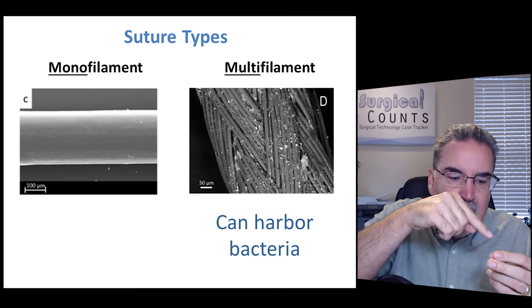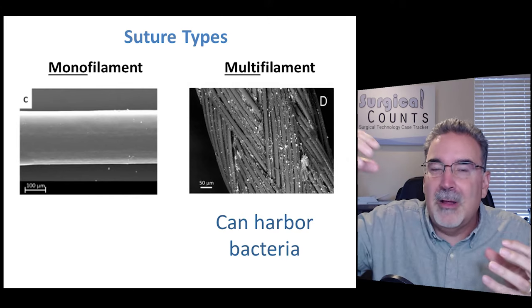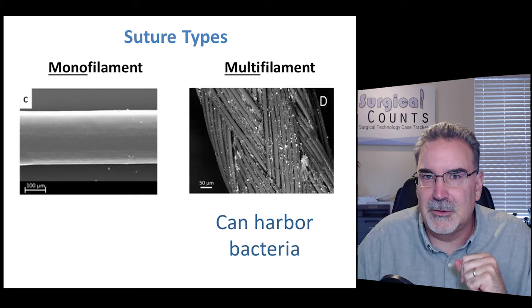The bacteria are going to follow it all the way along that wound, infecting now the entire wound, because they're protected by that multifilament suture.